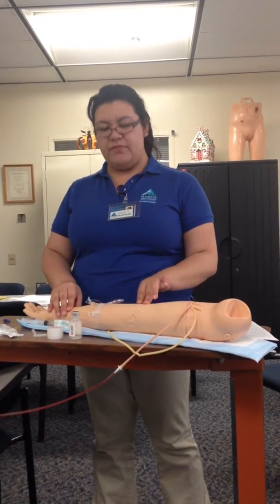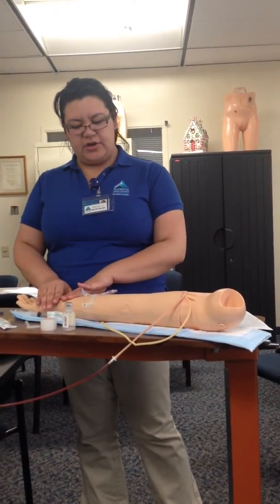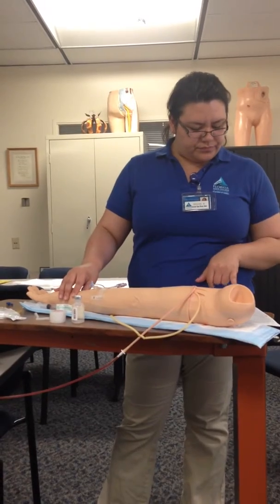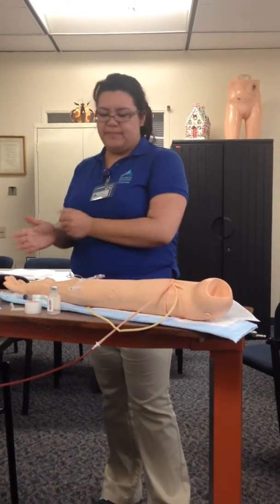Can you verify your name for me and your date of birth? John Jones, 2222. Okay, very good, Mr. Jones. Matches the wristband. I've seen in your chart that you don't have any allergies. Is this correct? That is correct. Okay, very good. So now I will wash my hands, and I'm going to apply clean gloves.